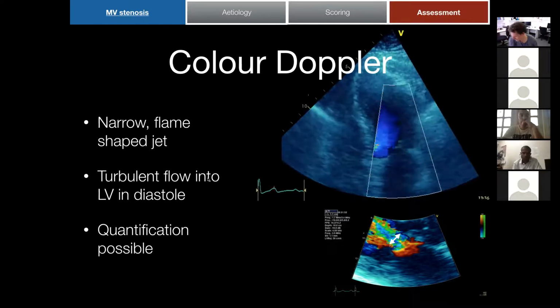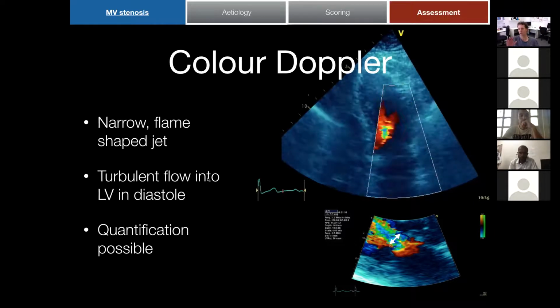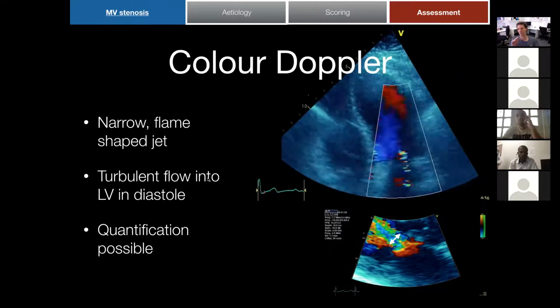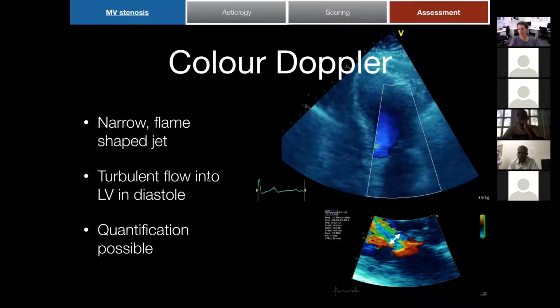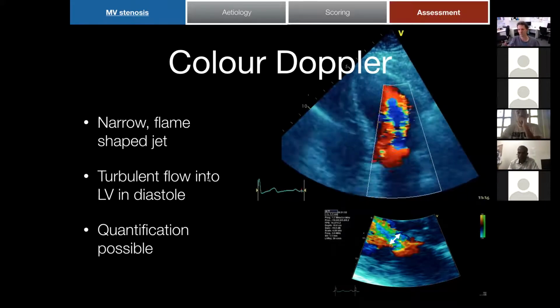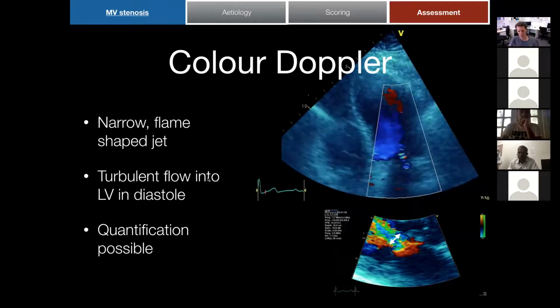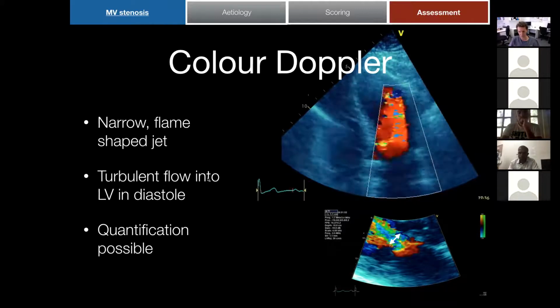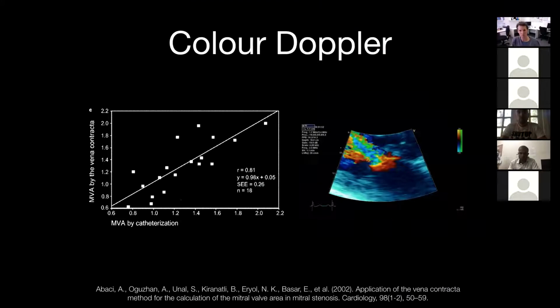Yeah, they talk about PISA, by the way, in this, and talking to my cardiology colleagues, PISA is not something that they'd use for stenotic lesions. It's mainly just for regurgitant lesions. They do talk about it in the literature, but it's not something that they recommend, particularly because of the abnormal shape of the orifice. All right, thanks very much, Vishal. Yeah, take out the vena contracta.